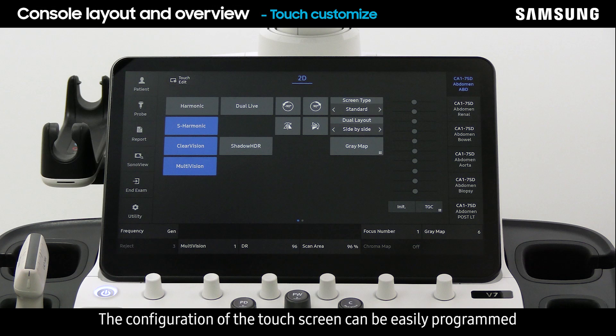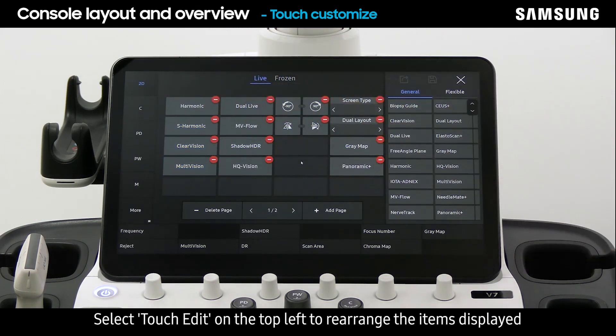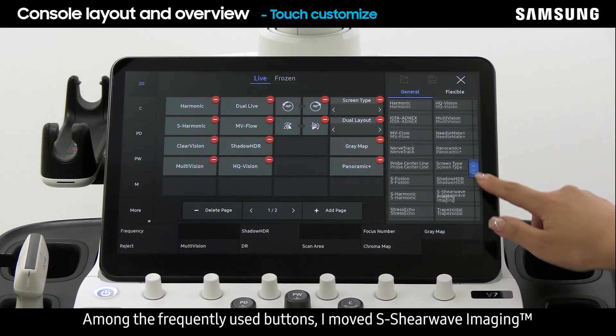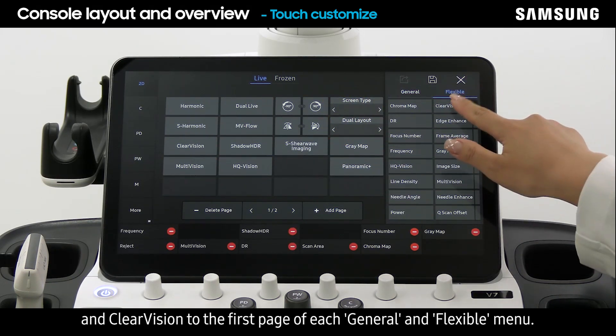The configuration of the touch screen can be easily programmed for the convenience of the user. Select Touch Edit on the top left to rearrange the items displayed on the general and flexible menus. Simply tap the items you wish to put on the menu page. Among the frequently used buttons, I moved S-Shear Wave Imaging and Clear Vision to the first page of each general and flexible menu.